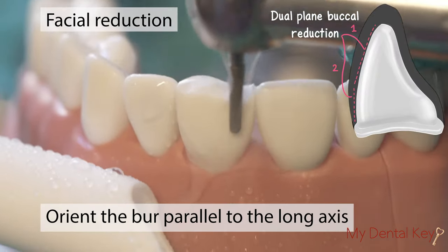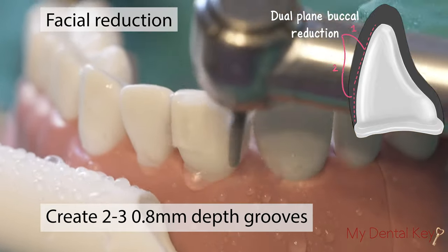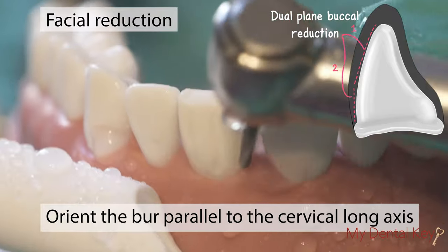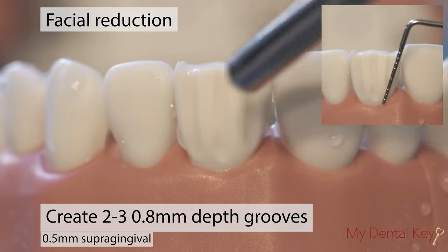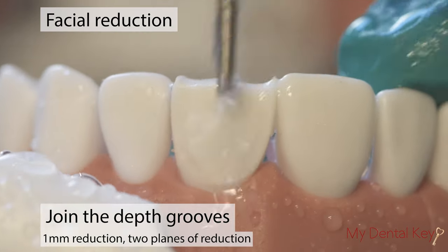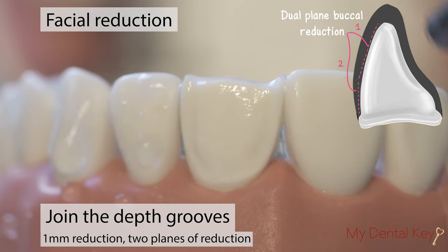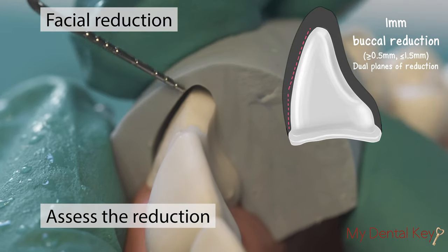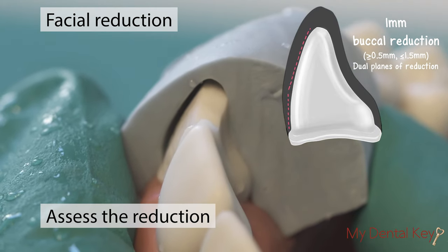For the facial reduction, we will create a dual plane of reduction. To start, create six 0.8 millimeter depth grooves, 3 parallel to the long axis of the incisal half of the facial surface, and 3 parallel to the long axis where the tooth emerges from the gingiva, 0.5 millimeters supragingival. Join together the depth grooves. The final facial reduction is 1 millimeter with dual planes of reduction following the contour of the tooth. Once this facial reduction is complete, compare the dual plane facial reduction against the facial lingual reduction guide and use your probe to measure for appropriate reduction.